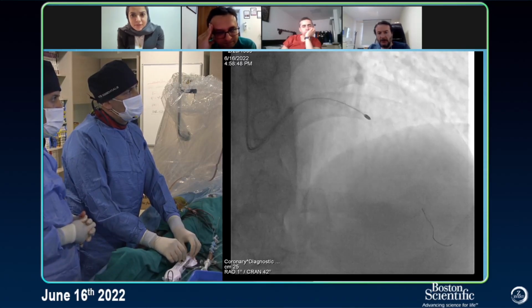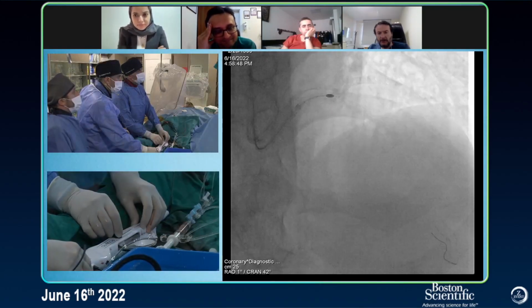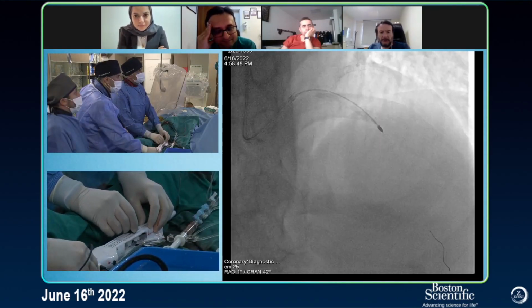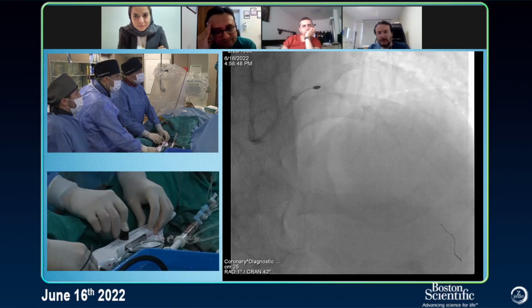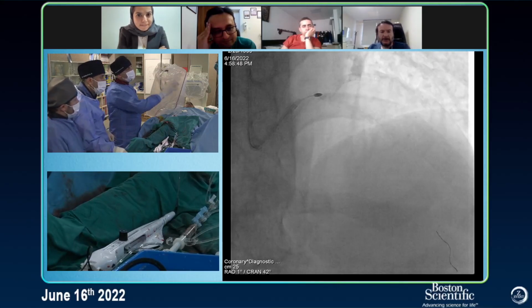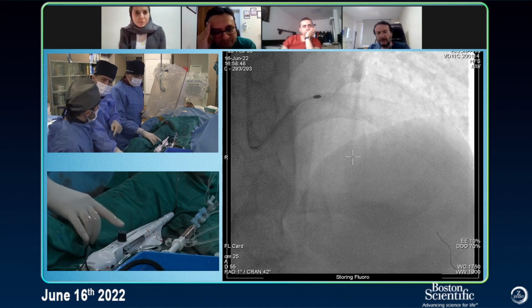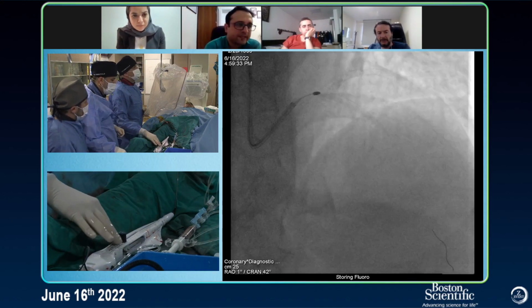This is nice. Definitely a change from the first one. Another run, okay. That's an important thing: we have to park our burr at the end of the rail, not the middle. You have to come back at the end of the rail.